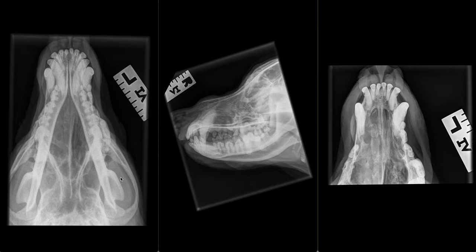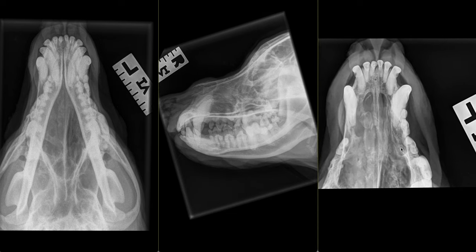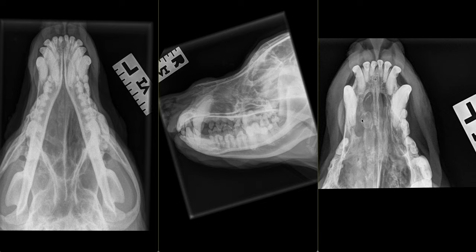What we observe in these radiographs is that there is markedly increased opacity in the right nasal cavity, with poor distinction of the nasal turbinates in comparison to a more normal left side. The nasal septum is mildly deviated to the left and is poorly defined or possibly lytic in the mid-aspect. There is a one-centimeter, well-defined, smoothly marginated, corticated, mineral opaque structure in the rostral aspect of the right nasal cavity.